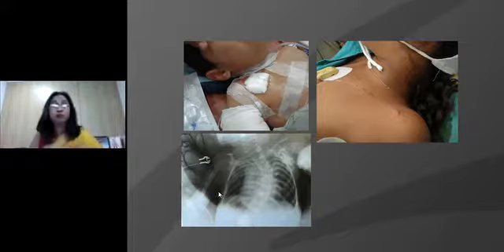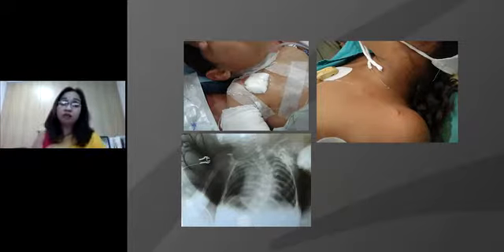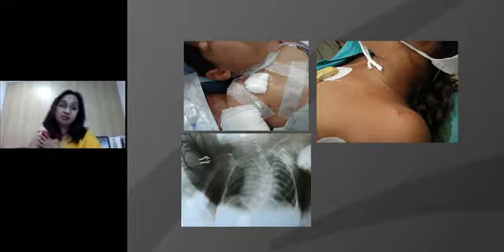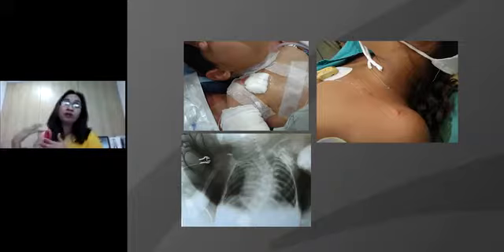We get good continuous catheters, or continuous infraclavicular techniques, by this approach, because the infraclavicular area really renders itself extremely well for anatomical fixation. The kid is going to be wiggly, but since there is not much movement happening here, unlike the axillary or the neck, this really works well.